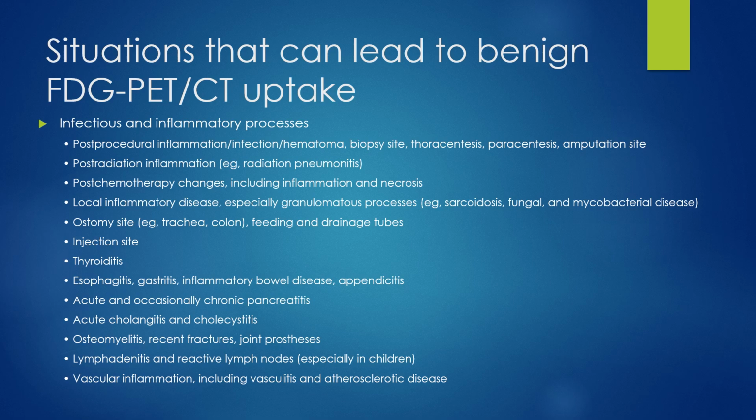It's going to show up, that will also show up on a bone scan. Lymphadenitis and reactive lymph nodes, especially in children, or any kind of vascular inflammation like vasculitis or atherosclerotic disease. Any kind of coronary artery disease may be FDG avid.